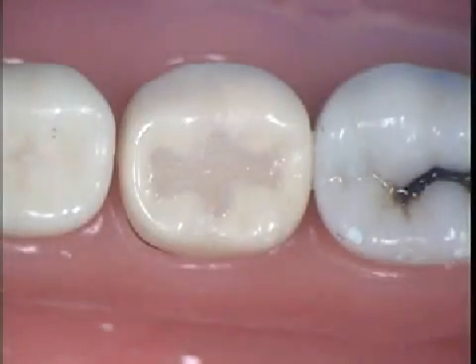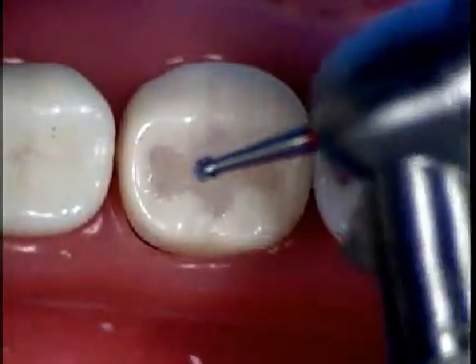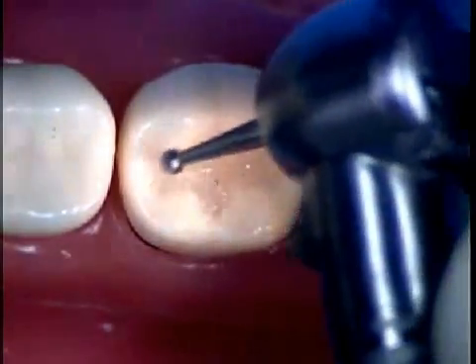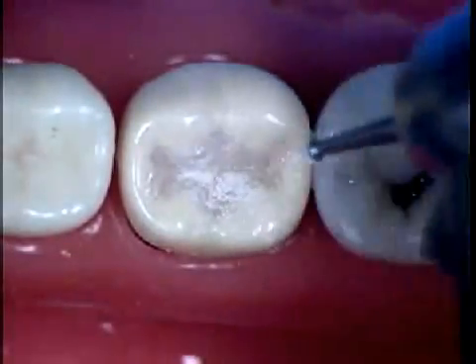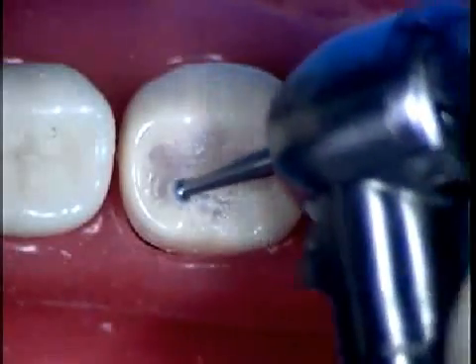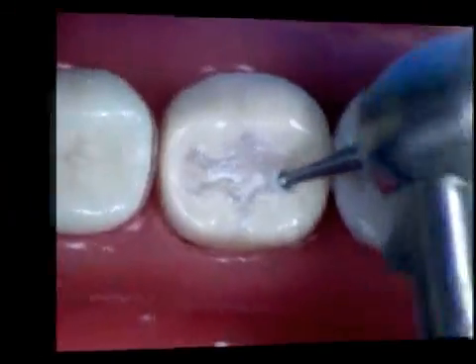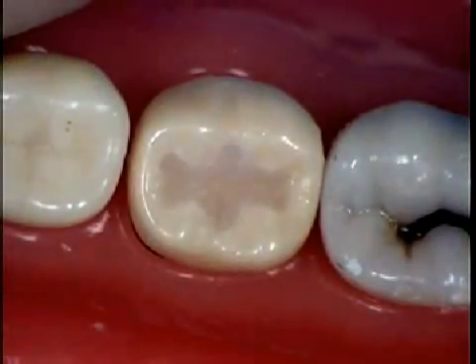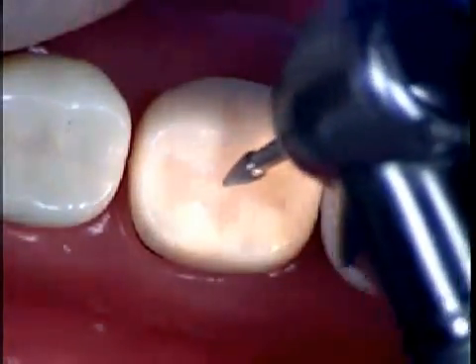The finishing of the margins should be done with a round 70-04 burr. If you choose to use high speed, you need to have water cooling. If further anatomy is required, you may use the burr H274 for the placement of this central anatomy.